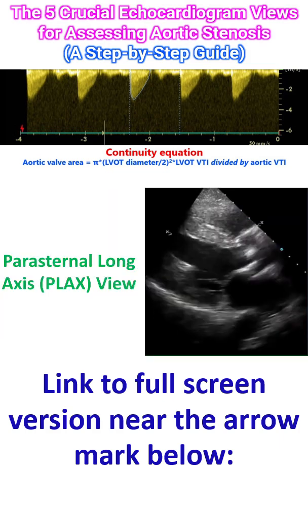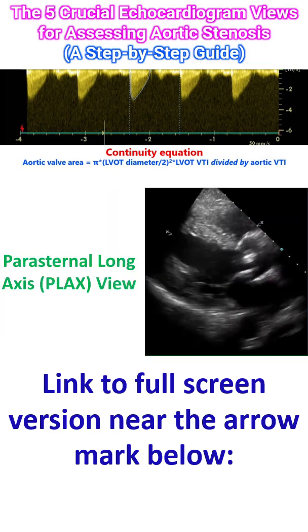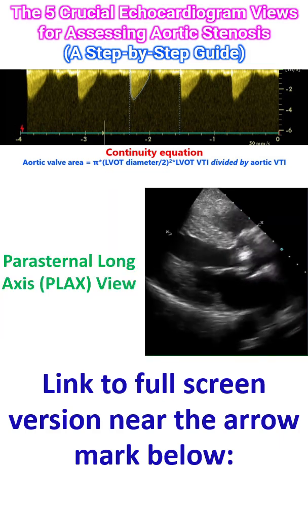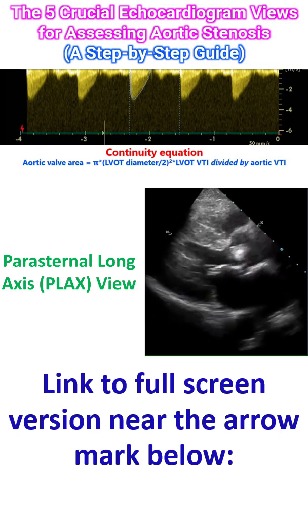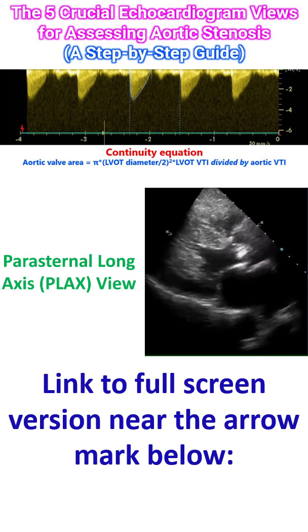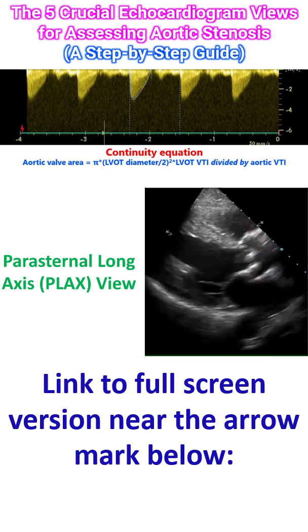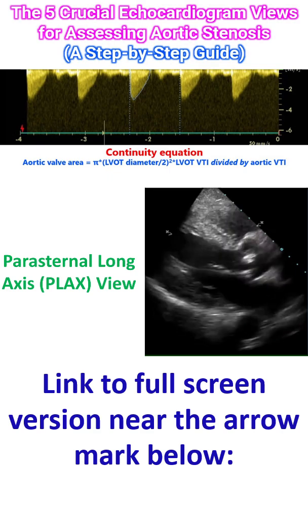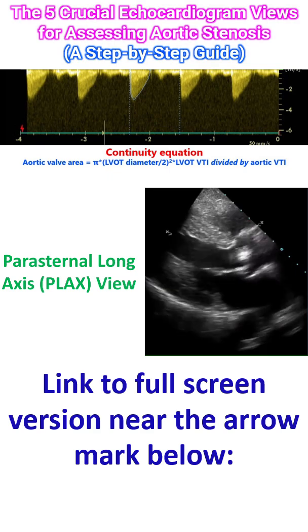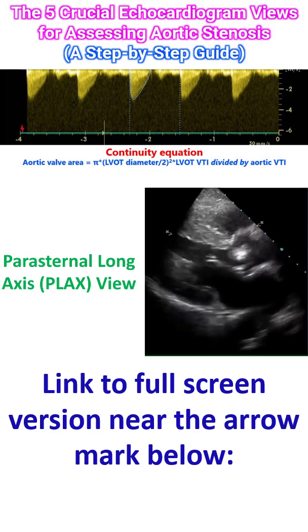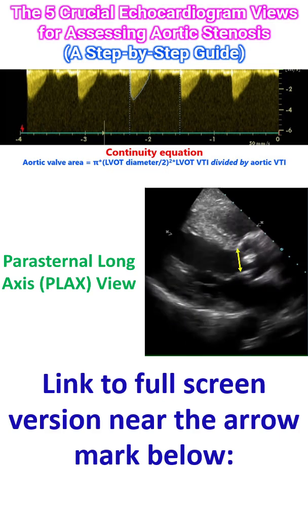The parasternal long axis view is the starting point for anatomic assessment and the first step in quantification. Evaluate the morphology, calcification, leaflet thickening and restricted motion, and doming. Then measure the LVOT diameter.